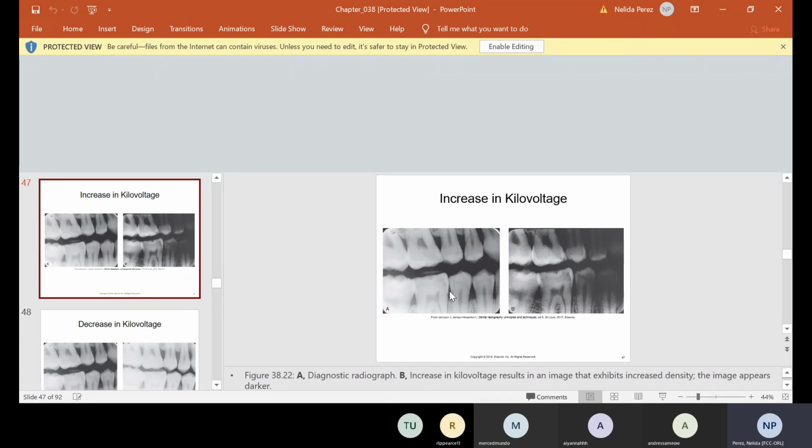We're looking for cavities. The doctor is looking for plaque. The hygienist also, okay. We're looking to see bone loss, okay. Yeah, there's a lot of things going on. So if you take an x-ray like letter B and the doctor did not ask you to take an x-ray like that, as you can see, it's very hard to see those premolars, interproximals, the mesial and distal.